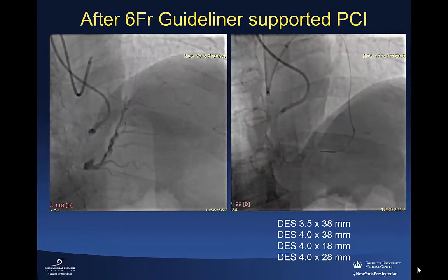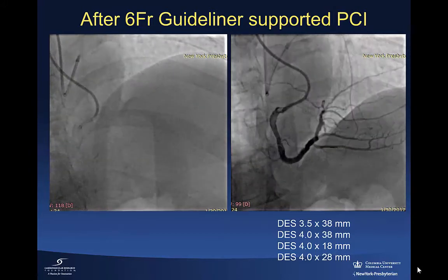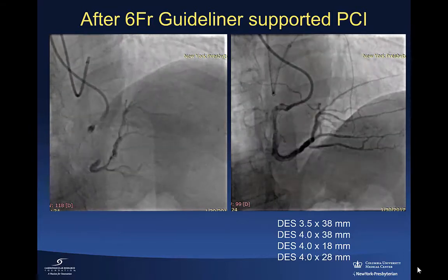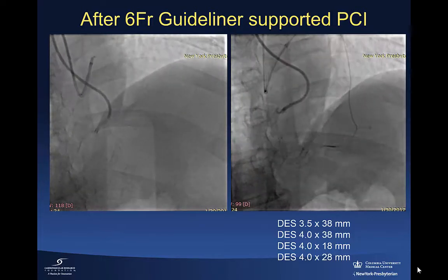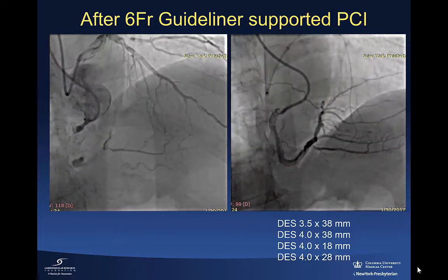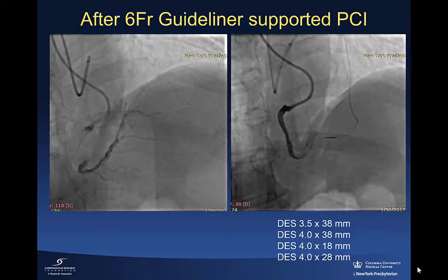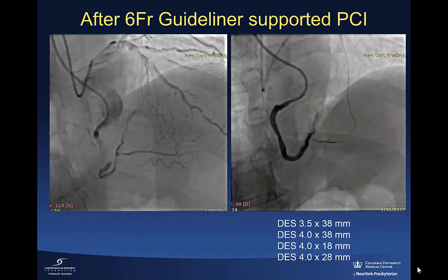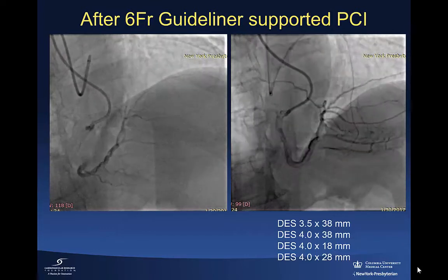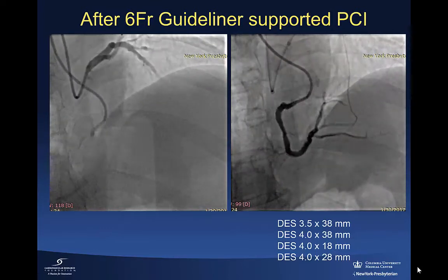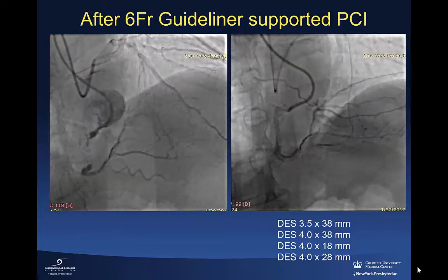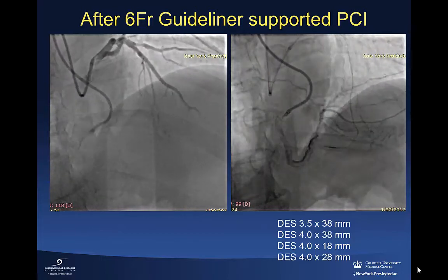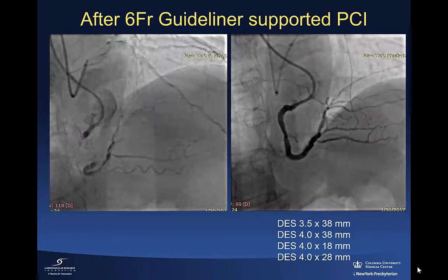This is the final result. It was a very calcified vessel, so probably JCTO4, not three — we didn't count that in the beginning. You see there's some residual stenosis; the area was adequate, close to five — more than five millimeter square. It was eccentric in the LAO; it wasn't that tight. We decided not to push our luck too much in this heavily calcified and tortuous segment, especially knowing that we had dissected. We had pushed the calcium probably against one part of the vessel, so to avoid the risk of a perforation, we accepted that result, and the patient was discharged in good condition. Six months into follow-up he's doing very well clinically.